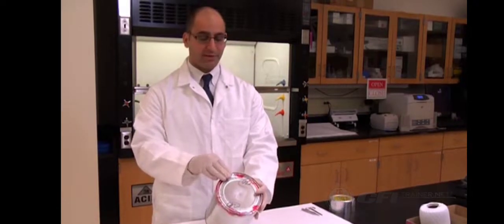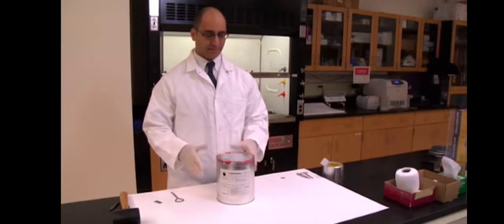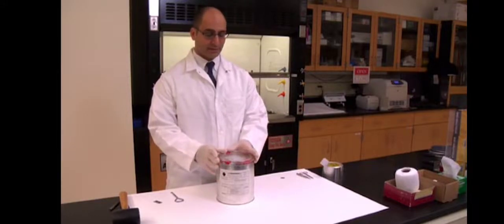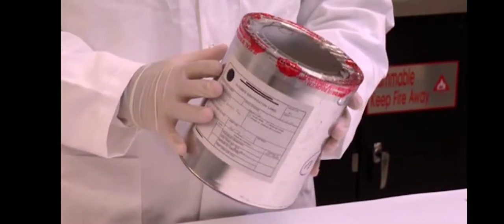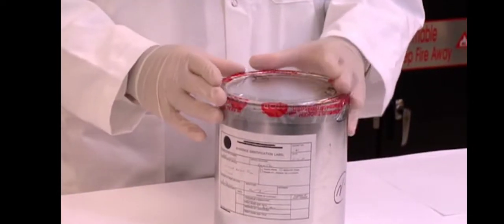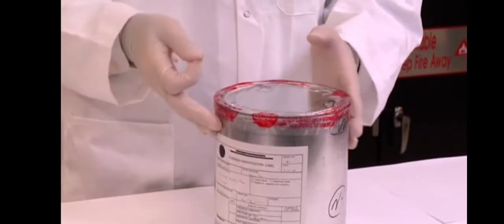You want to make sure that you have enough headspace in the can so that we can do our analysis. After we pick up our evidence from the vault, it's brought to this laboratory, to this station, which is our sample preparation station. At this point, we would take a look at the item. If it's in a metal can, we would make sure that the seals are intact, the lid is on properly, and everything is labeled properly as well. Once we're satisfied and everything's documented, we can then take a look inside the can.